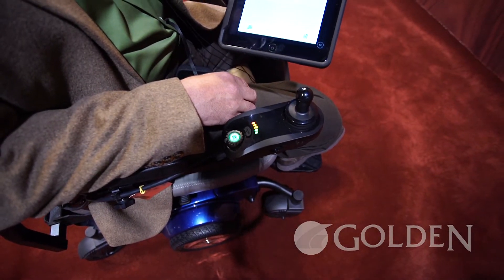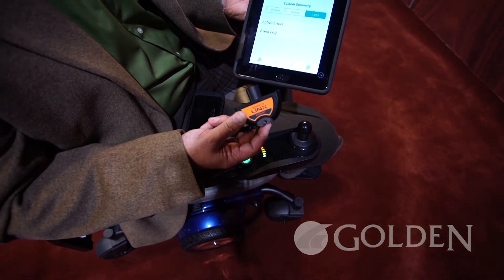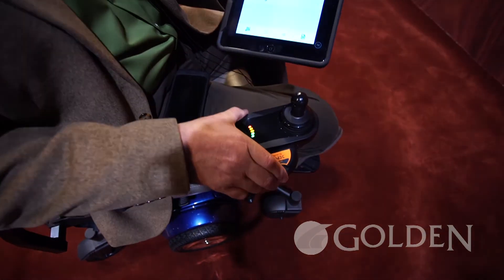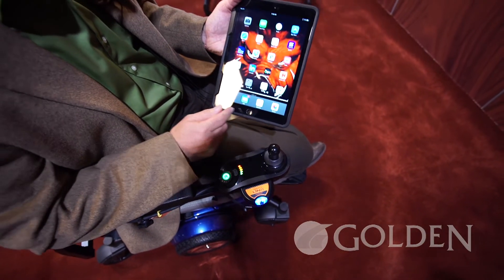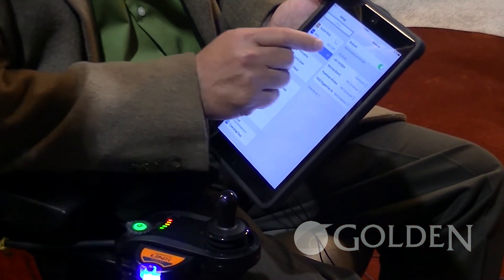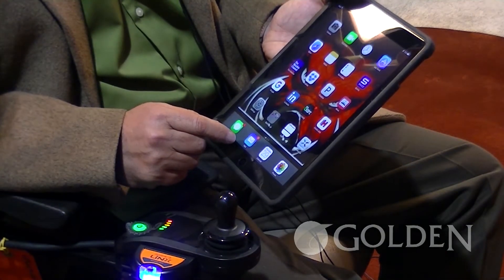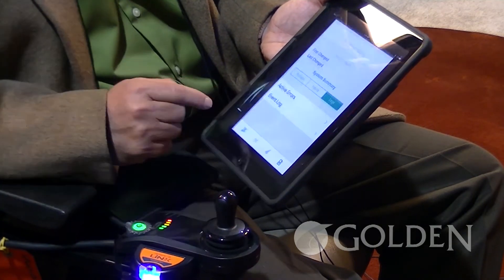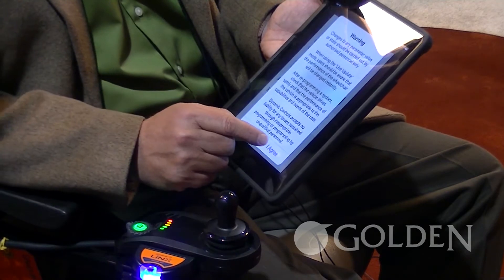We've done away with the handheld programmer. We now use the access key — it's a Bluetooth activation key that is inserted into the side of the joystick. With this, we go to our settings like any Bluetooth device setup. We'll go to the link access key, which is already connected, and then back out of there. Then we'll go to the links access app, which is a free app, hit the Bluetooth icon, and agree to terms.